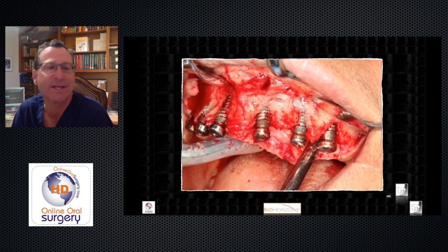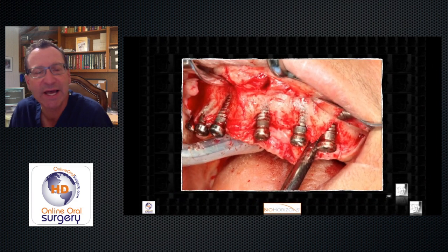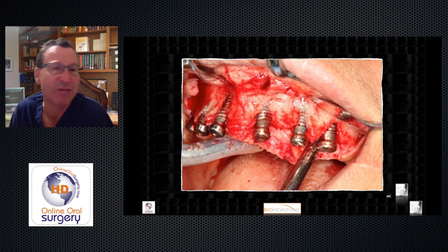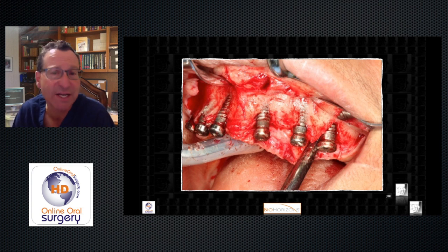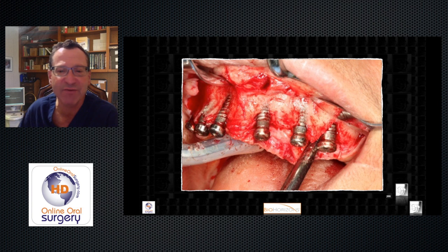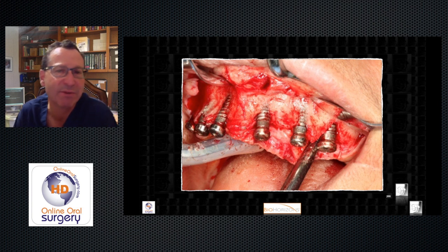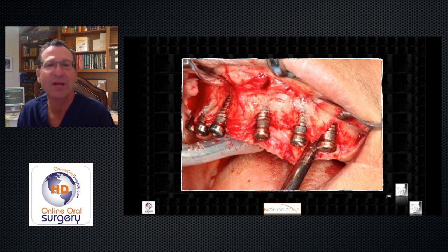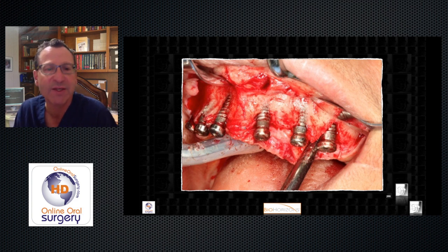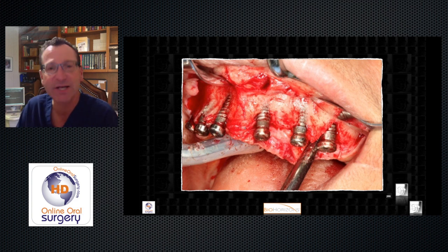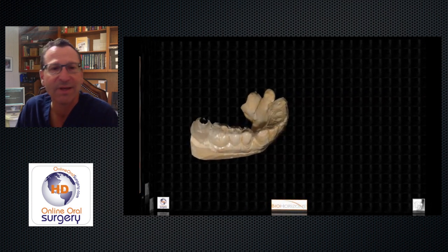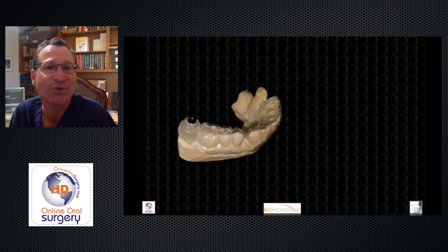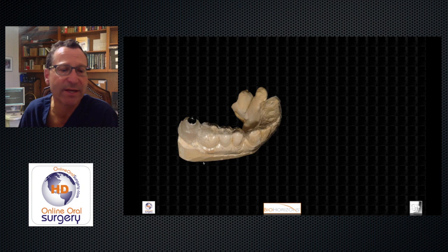Here's another case — not done by me — where the patient had implants placed by flapless surgery using a surgical guide made off of a study model. You can see that pretty much every one of those implants is placed too far to the facial, because the two-dimensional panoramic didn't tell us the three-dimensional width of the bone, the clinical exam was deceiving, and the surgical guide just misled us.